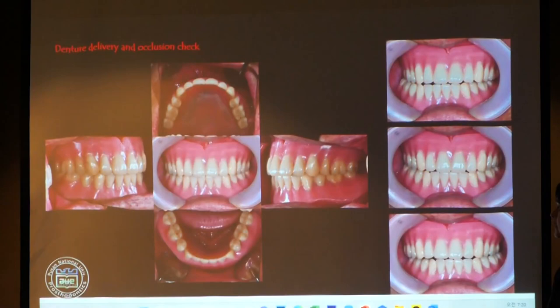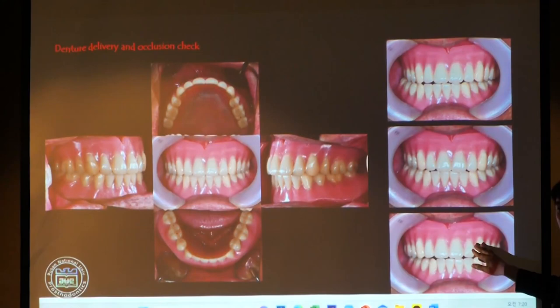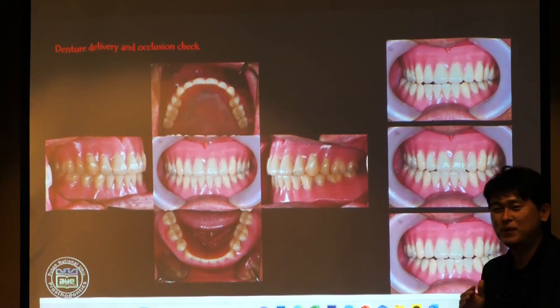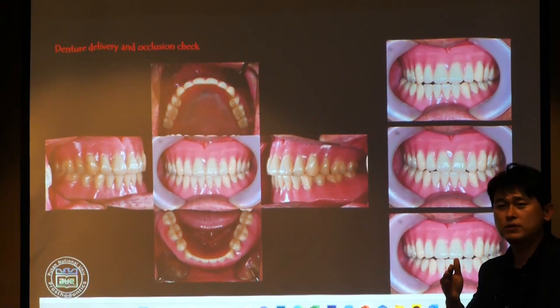The final dentures, and then we can adjust the occlusion one more time with the bilateral balanced occlusion. I want to emphasize the exact method of how we can make the full denture. But in the clinical situation, we want to reduce the patient's visiting steps. Yes, that's natural, I think.